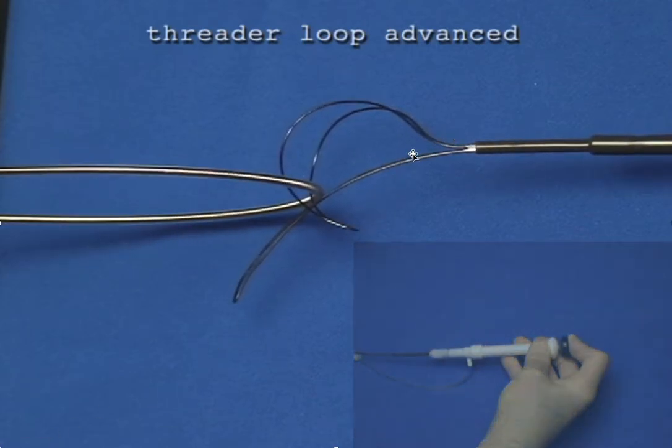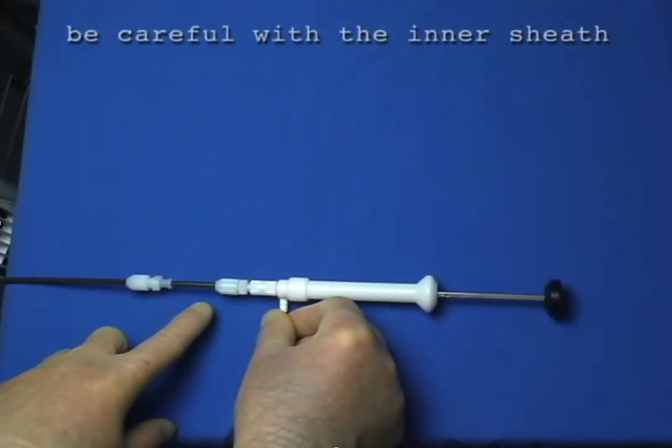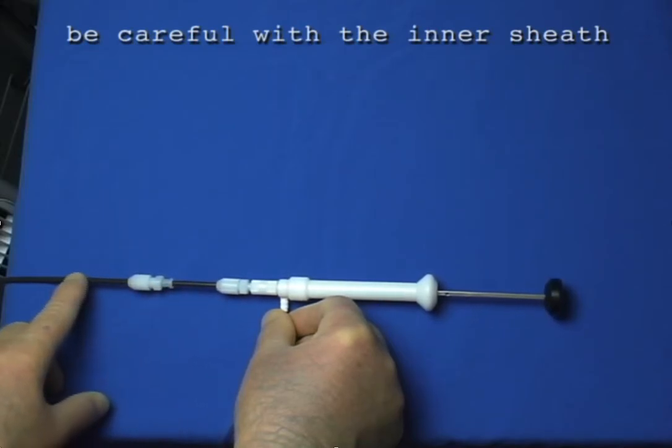If when you extend this threader loop, it goes in here instead of out here, then you don't catch the lead, but you activate this threader loop by the plunger. And here's the part that can be really confusing. Once you have the threader loop engaged properly, you need to lock the snare in place, and that's where this inner sheath that I mentioned comes in, the curved inner sheath or the straight inner sheath. You need to slide this forward to lock it into place.